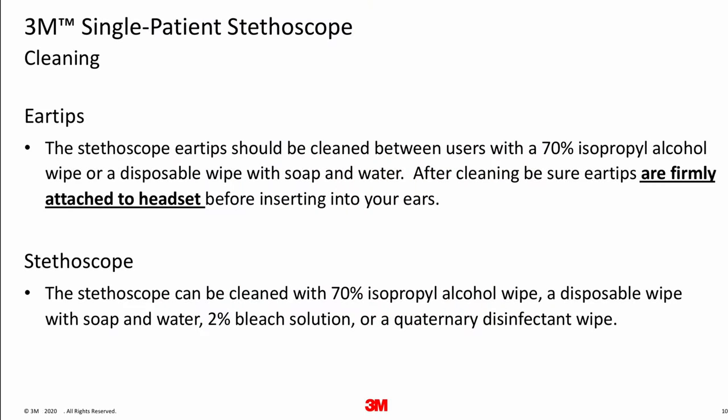I'm going to end with cleaning instructions. Between users, it is recommended to clean the stethoscope. Remember, this is a single patient stethoscope, so it should not be used on multiple patients. The stethoscope ear tips can be cleaned with a 70% isopropyl alcohol wipe or a disposable wipe with soap and water. After cleaning, be sure the ear tips are firmly attached to the headset before inserting them into your ears. The rest of the stethoscope can be cleaned with 70% isopropyl alcohol, a disposable wipe with soap and water, a 2% bleach solution, or a quad disinfectant wipe.